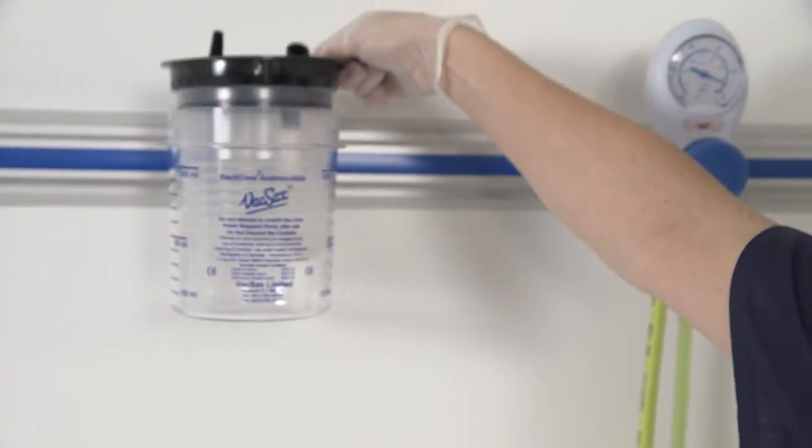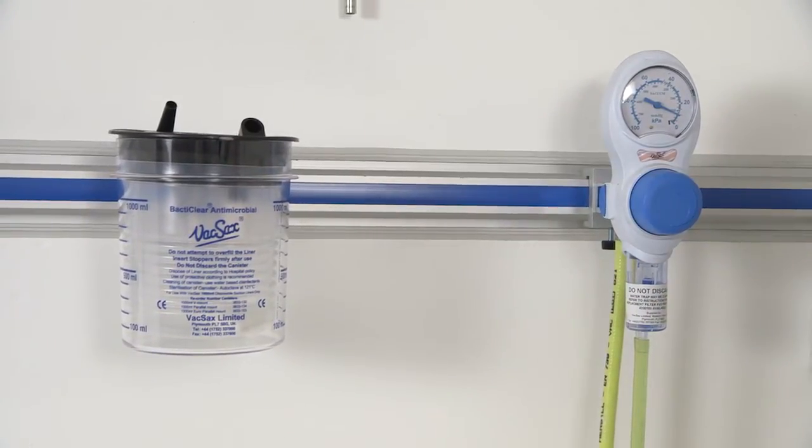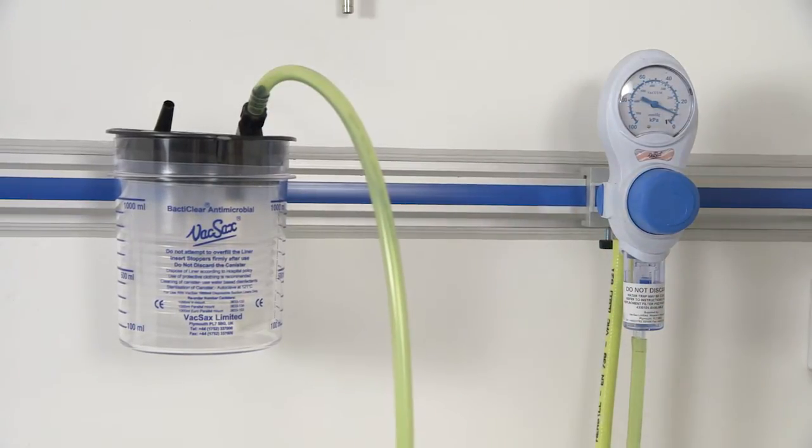Place the black lid liner into the canister and press home firmly. Connect the black vacuum tapered connector into the vacuum port located on the liner lid.